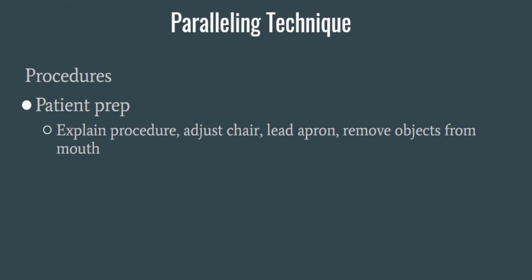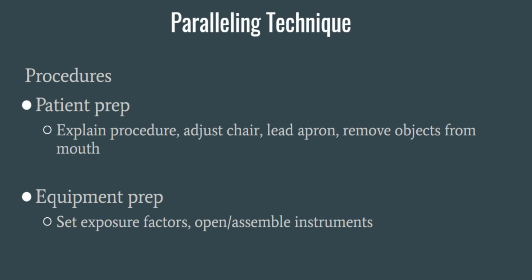It can alter the way that a tooth looks. So it'll cause an error on the film that we need to make sure we can eliminate by having them remove anything that may be in their mouth. And then we have the equipment prep. We want to make sure we have all of our exposure factors set correctly, and we want to open and assemble any of our instruments.